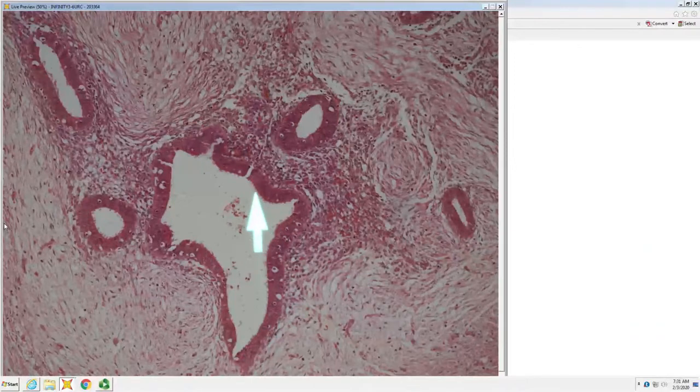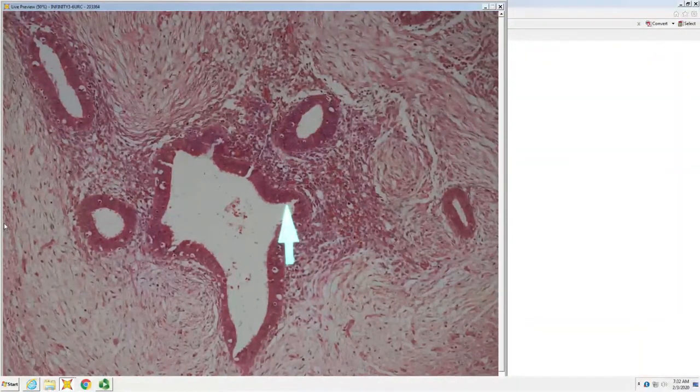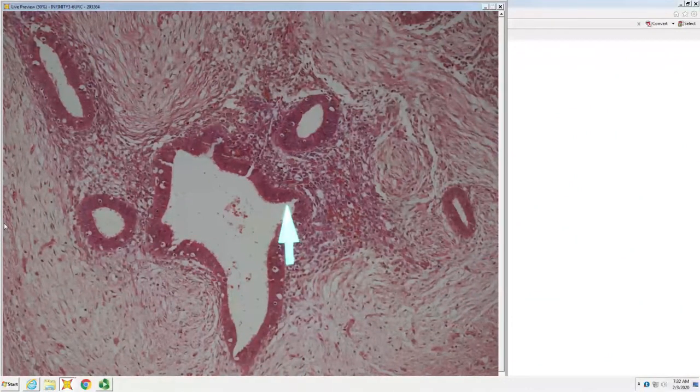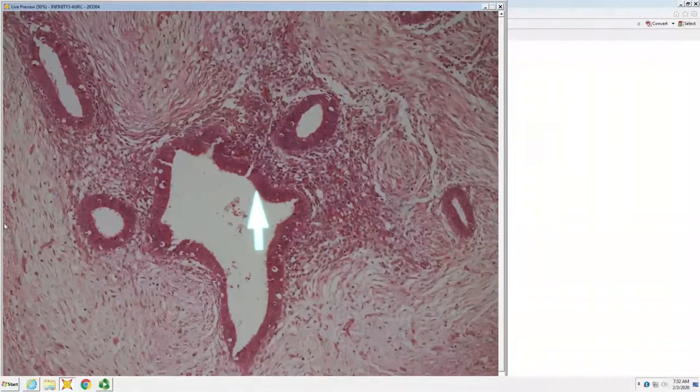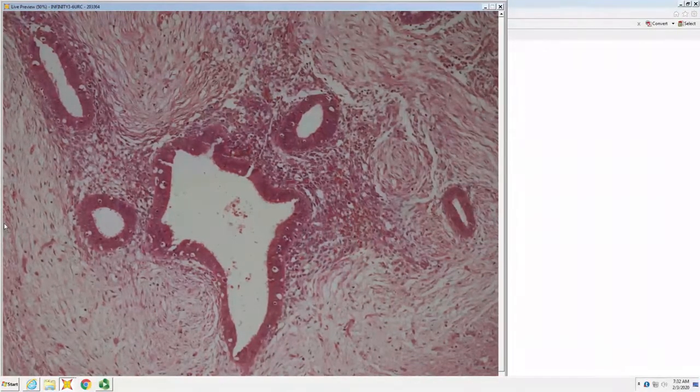So, endometriosis. Endometriosis was one of the important simulants of metastatic disease. You're going to see a highly proliferative and sometimes mitotically active columnar epithelium, looks secretory, and then the key is really the stroma. You have a fibromyxoid stroma, plump mesenchymal cells, and red cell extravasation, and often hemosiderin because it bleeds in a monthly fashion. So endometriosis would be an important simulant of metastasis that is pretty much in your scope of practice to identify.